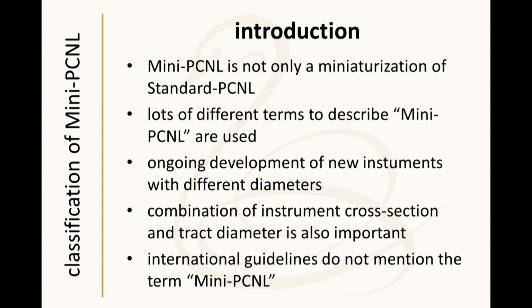And another point is very important. Up to now, there is no international guideline available who is mentioning the term mini PCNL. In fact, this means that mini PCNL is not existing from the viewpoint of the guideline panels of the AUA and the EAU.